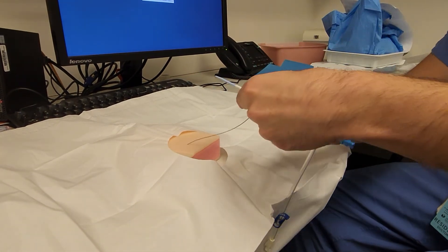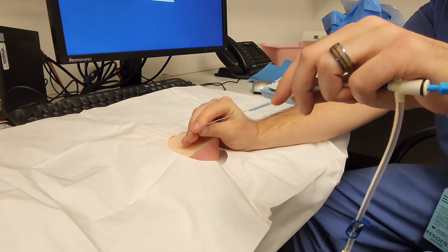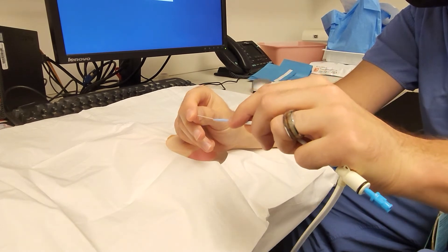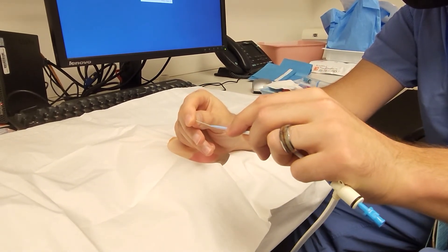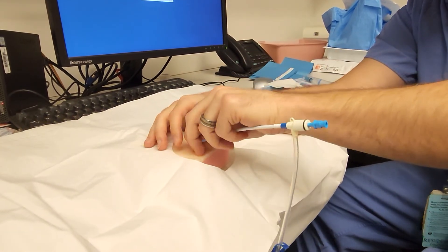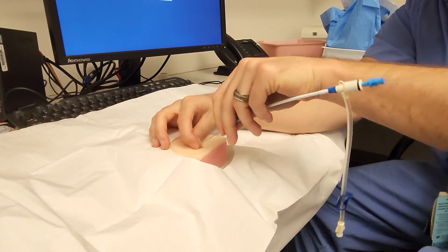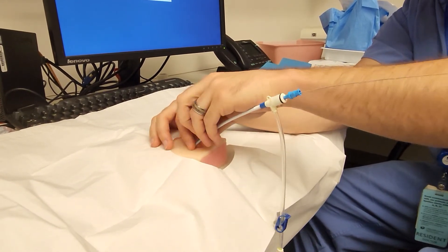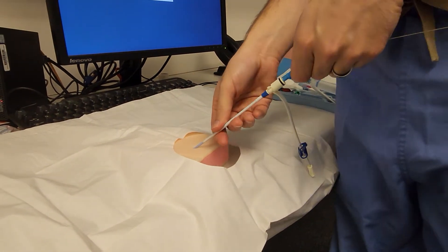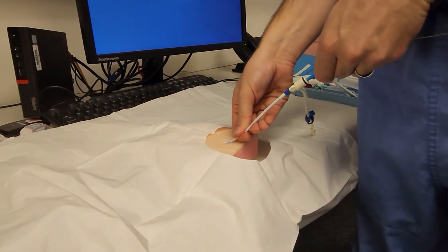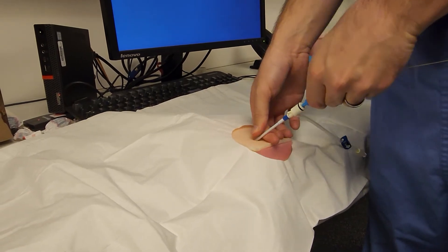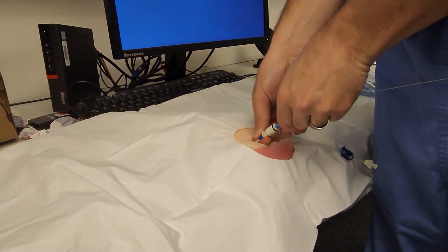And then you're going to thread the wire through the dilator and the cordis itself. And now the key with this is you're going to insert everything and hub it. So dilator and cordis all the way in.